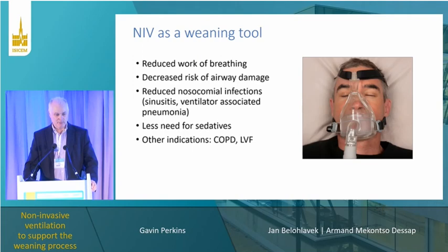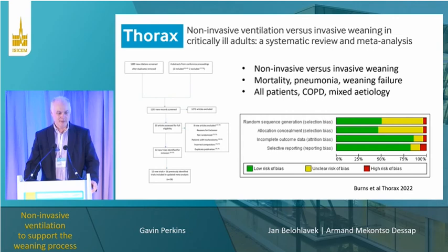So non-invasive ventilation, again in the interest of time, I'm not going to dwell on the benefits of it as a tool, but physiologically, it helps improve the work of breathing. It potentially reduces the risk of barotrauma, airway damage, and ventilator-associated infections. Patients require less or no sedatives, and there's a specific evidence base to support its use in patients with COPD and left ventricular failure.